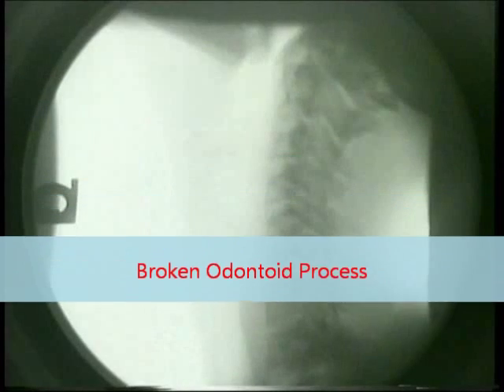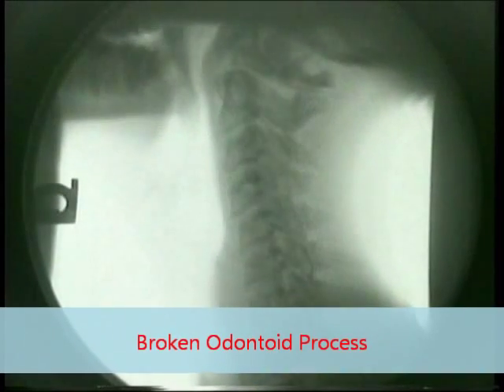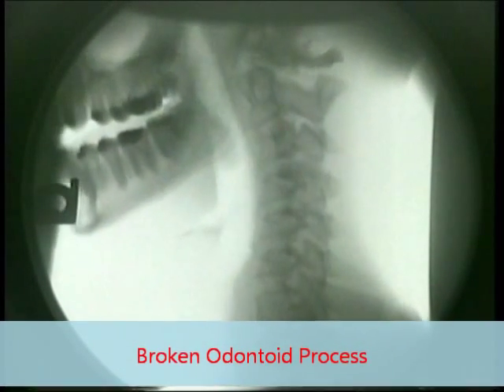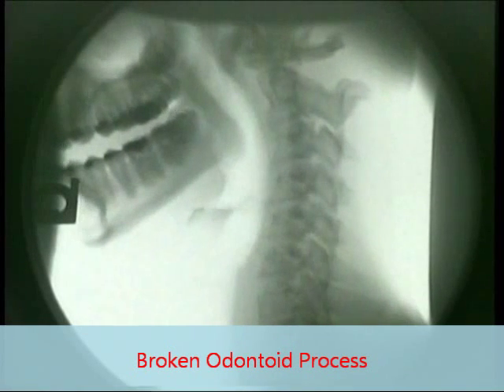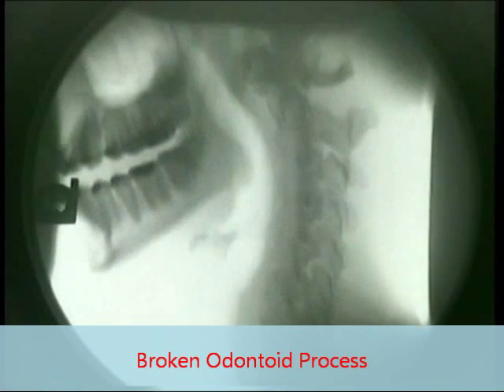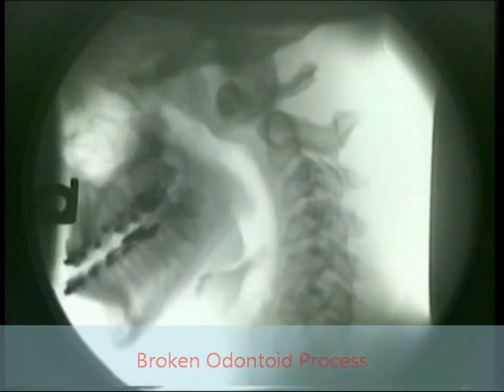These two studies demonstrate what a broken odontoid process looks like in motion. Both of these patients were released from the hospital following low-speed crashes with negative plain film findings. Trusting an emergency room diagnosis may lead to your worst nightmare. Be sure to fully evaluate cervical spine injuries prior to treating them.